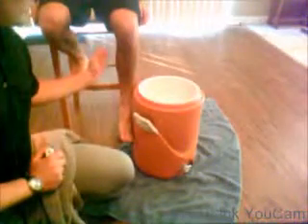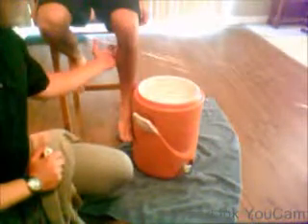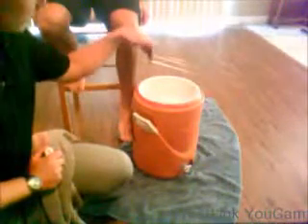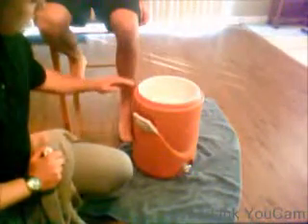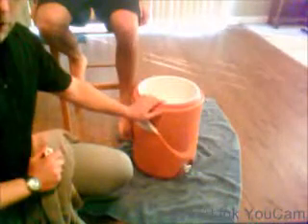When we insert the aforementioned limb into the tub, you want to make sure that the patient does not have the sides of the tub impact the sides of their leg too hard. There's not much pressure. You also want to make sure the limb itself is fully immersed into the tub, at least 6 inches above the injury site. So here we have the tub.